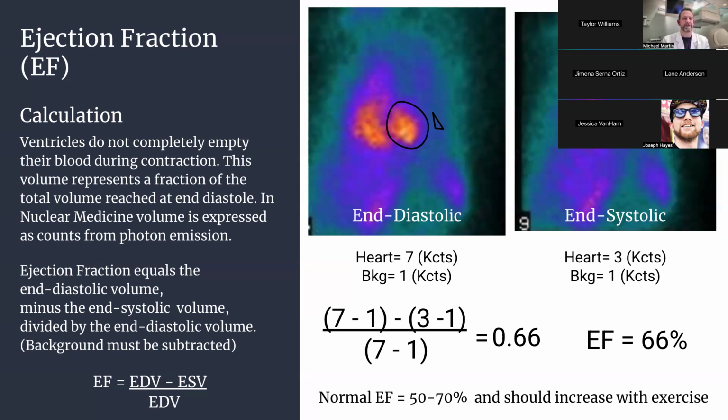Okay, thank you. And also, I was wanting to know, this doesn't appear to be smart zooms, but would a smart zoom help in this process by allowing us to see the heart better or no? It could, because again, most smart zoom cameras are kind of angled in. So again, it's going to match the pattern of radiation. So you could get counts at least quicker. You certainly could probably shorten your time because generally you're blocking fewer counts, right? And so you're going to get more counts faster. So yeah, it could. Thank you so much.